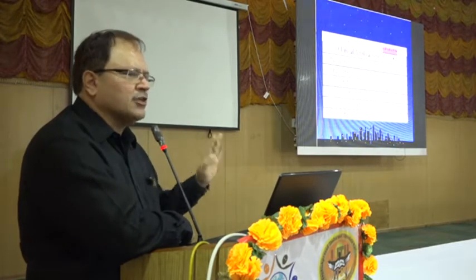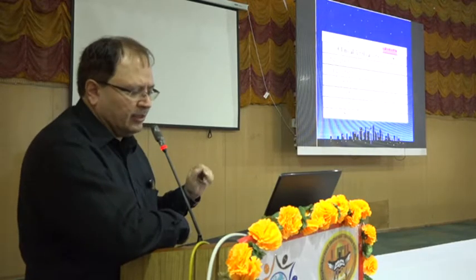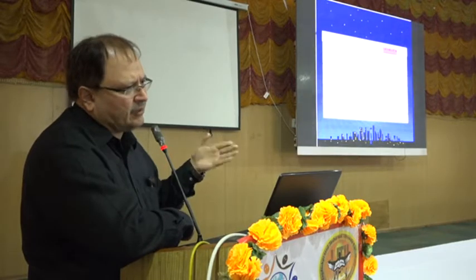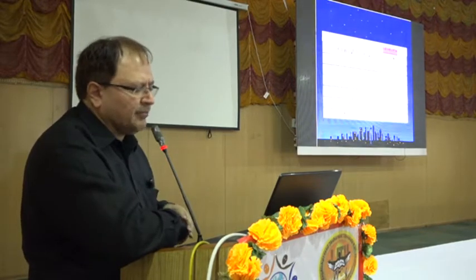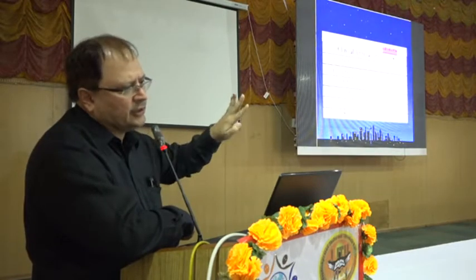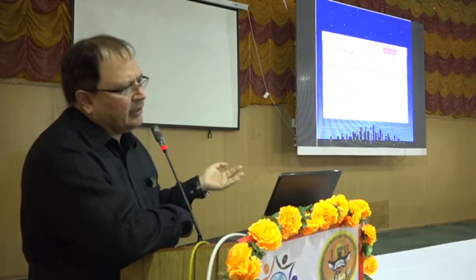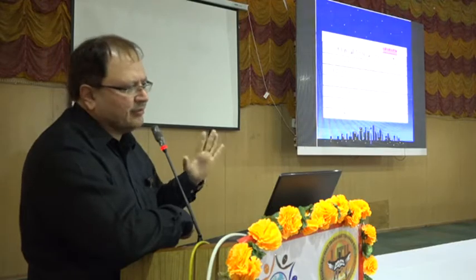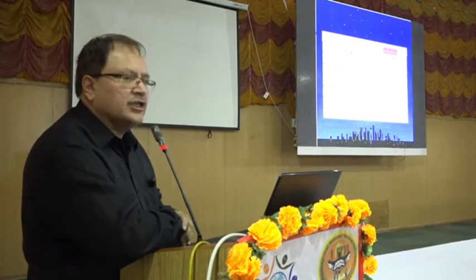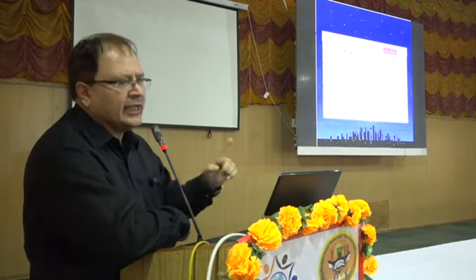IVUS is the best mode of investigation, which will decide whether you should subject the patient to angioplasty or to medical management. If IVUS shows the lesion is more than 70%, then you should put a stent, and if it is less than 70%, you should manage with medicine. IVUS is very useful in unstable plaques. It is most important in case of the left main artery.